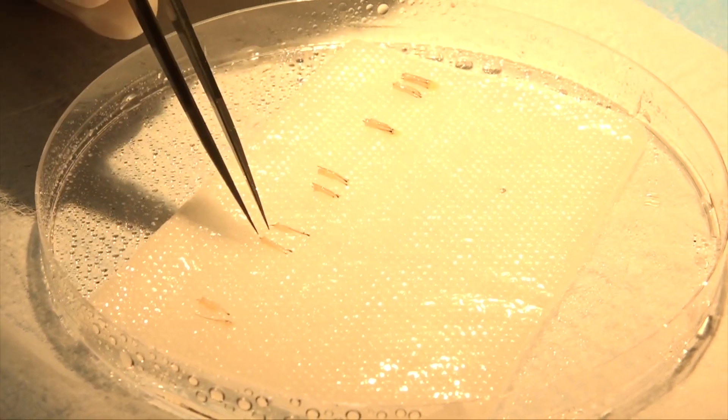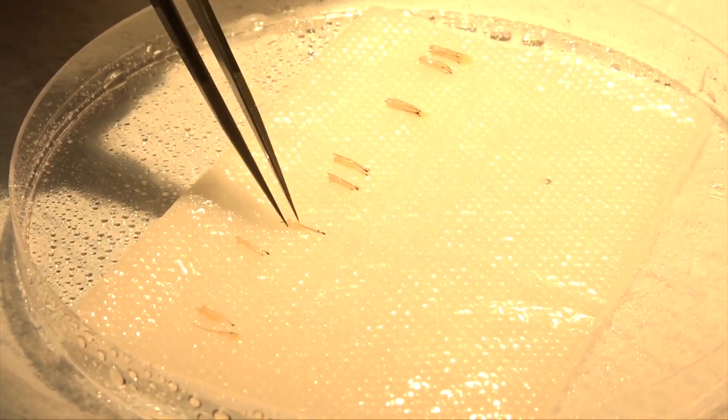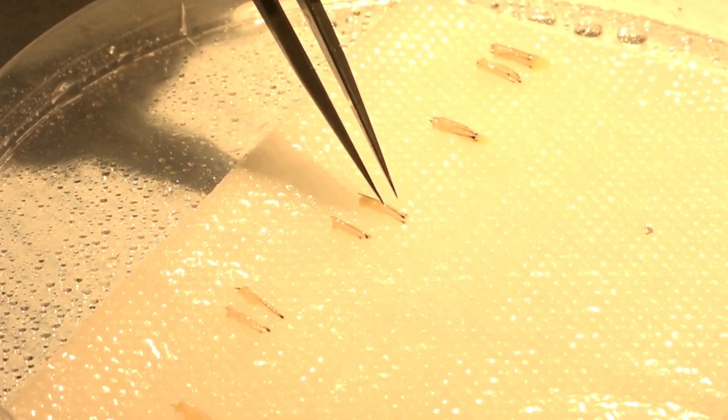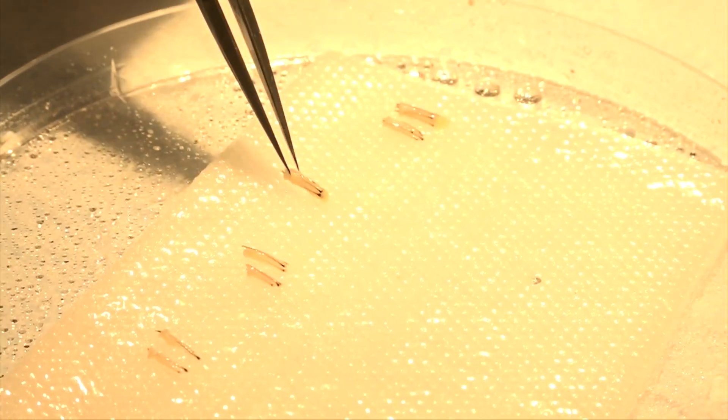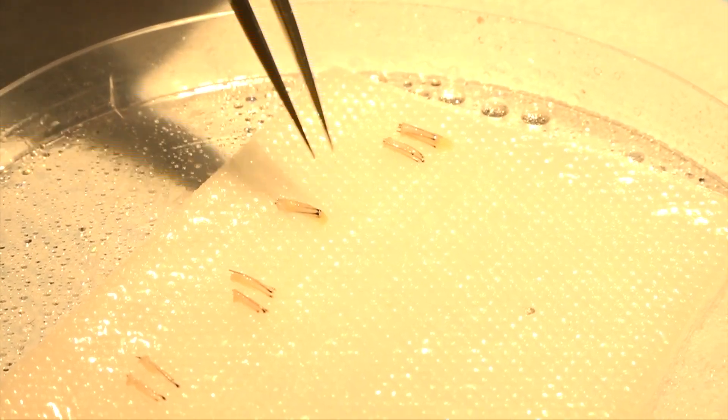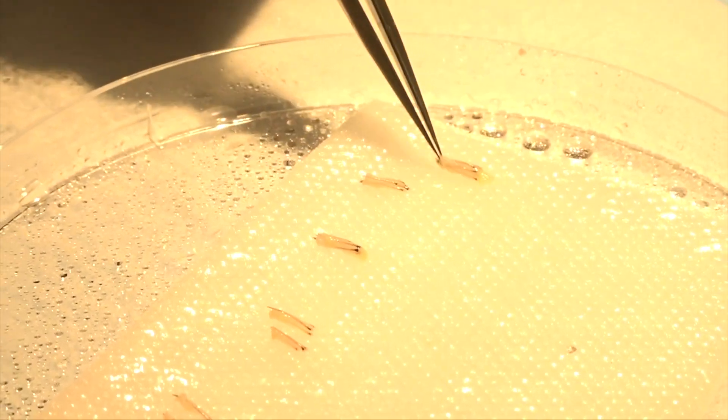Units. These are twos, you can see the two follicles at the bottom. We have threes, and Nick had amazing density, so we even have some fours and five hair units, which will be great to create that density that we are going for.